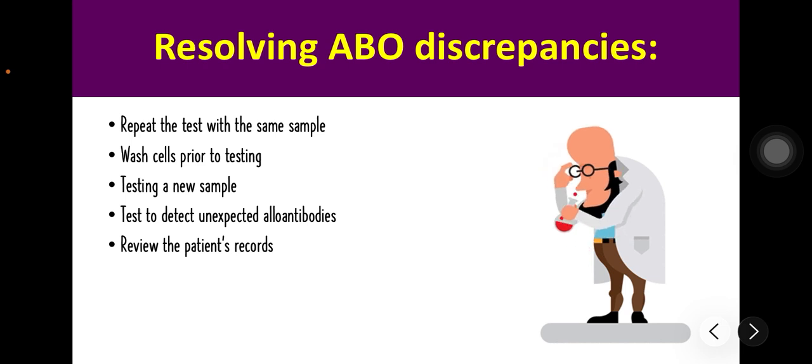that causes non-specific clumping. For neutralization by BGSS, some cancer patients have excessive soluble blood group substances in their plasma that neutralize the laboratory's antisera before it can react with the cells. So washing removes these substances to allow a clear forward typing. We also have cold autoantibodies: using warm saline at 37 degrees Celsius to wash the cells can elute or strip cold-reacting autoantibodies that are causing the cells to agglutinate spontaneously.